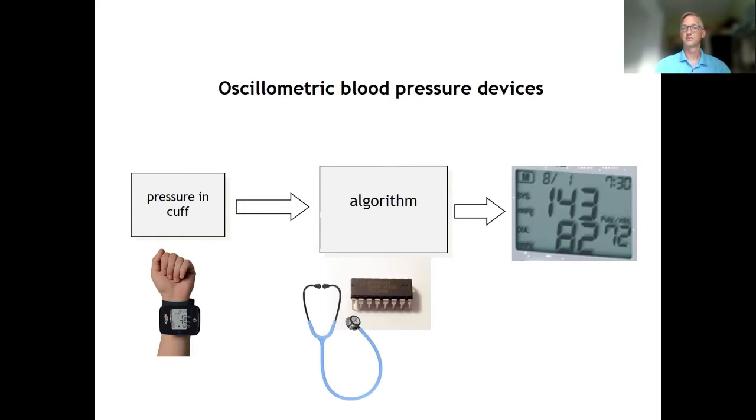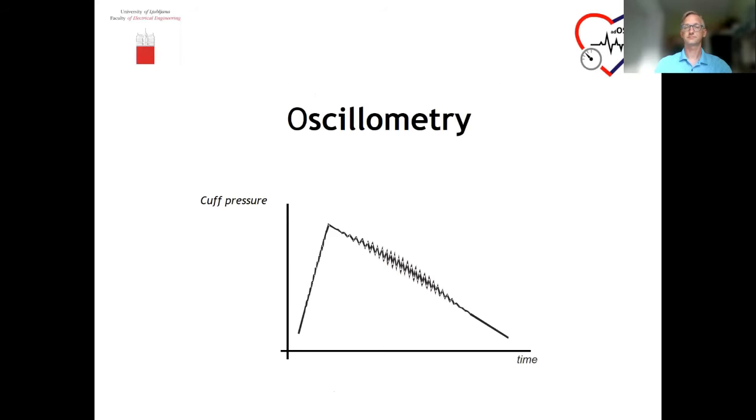Because if you wanted to test such a device, whether it's accurate or not, you have to know how the algorithm works. But you usually don't, because none of the producers is so stupid to tell you what kind of algorithm they used in their device.